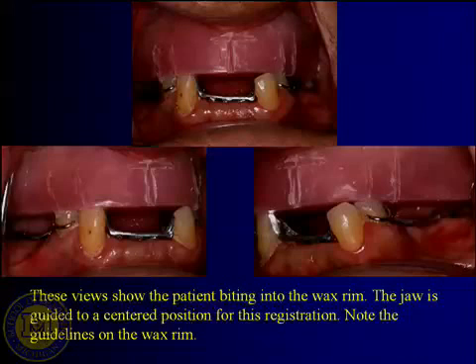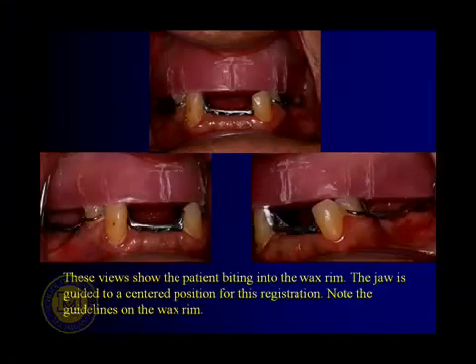How many of you have worked on dentures so far? Of any kind? Okay, so how many of you have had, when you try your maxillary record base in, you put in your upper record base with the wax occlusal rim on it, you put it in the patient's mouth, and you take your hand away, and the record base falls down immediately. So you're trying to figure things out, and you put it in, and the second you take your finger away, it drops down. So you're saying, how in the heck am I supposed to get biting relations when the record base won't stay there? So how do you suppose we fix that?